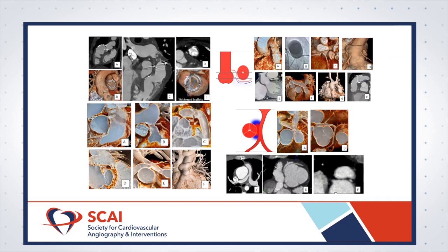And then the other pictures here really show the relationship of the coronary arteries to the right ventricular outflow tract. I think that when you're looking at low versus high risk patients, a coronary anomaly is important.